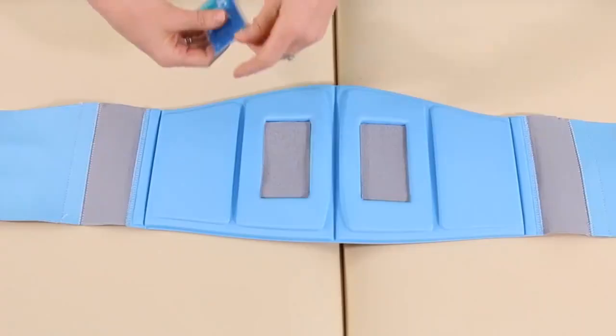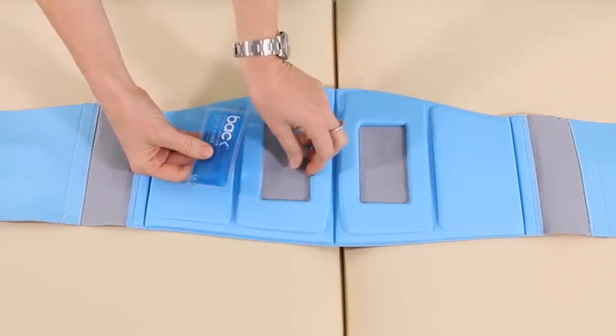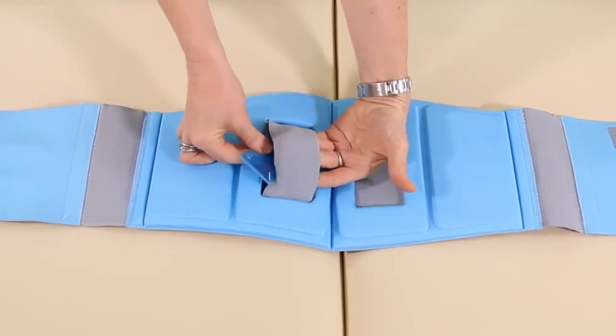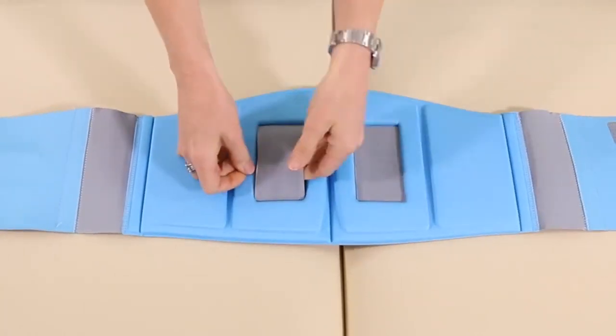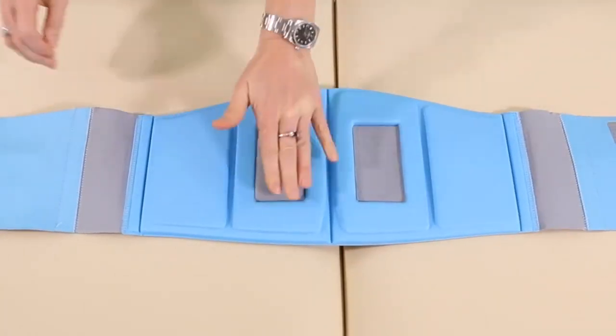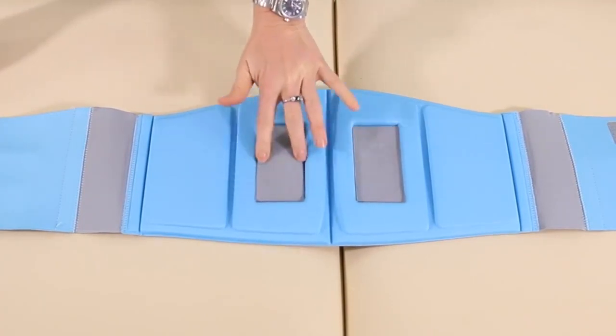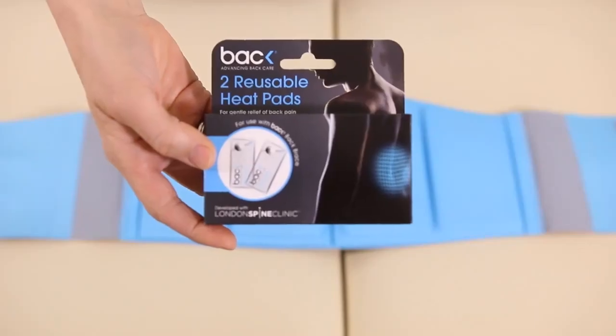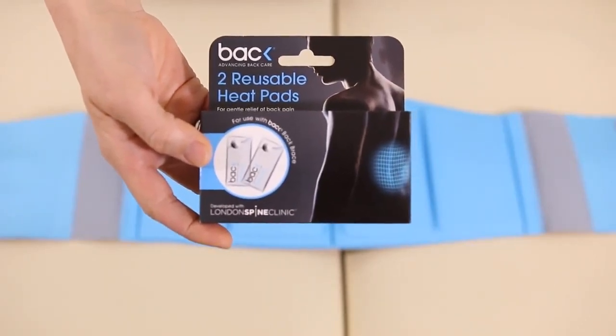The back brace comes with two cool pads. They pop into these little sections here. Just pop your finger into the elastic, lift it up, and pop the cool pack snugly underneath. Then when you place it on your back, the cold will permeate through into your spine.